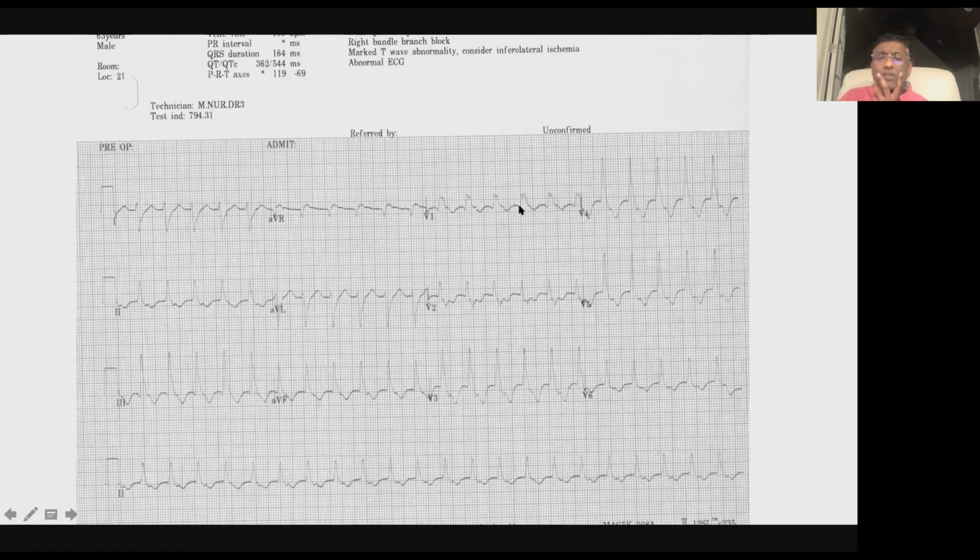Okay, so now you know the QRS starts here and probably ends about here. One big box is about 200 milliseconds, so this is almost a 140 to 150 millisecond QRS complex, maybe even a little more than that. So it is a wide complex rhythm. It's not that fast, I'd give you that. And I do agree that it's a right bundle morphology wide complex tachycardia.